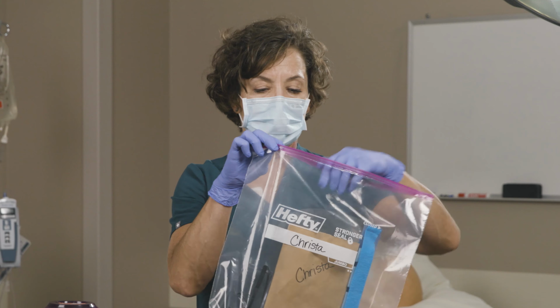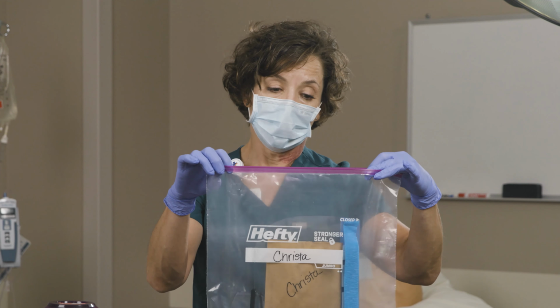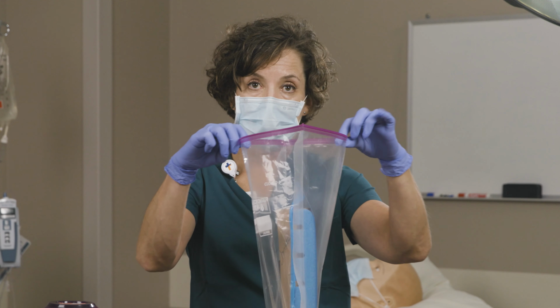So remember, since your N95 is stored in the paper bag in here, you do not want to seal your Ziploc bag. Keep it open at the top.